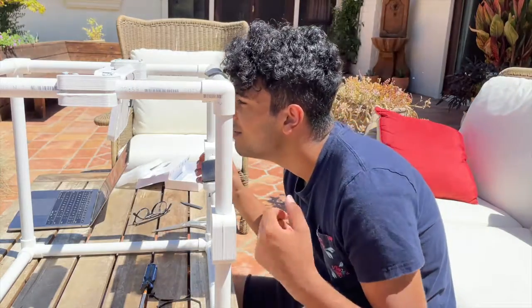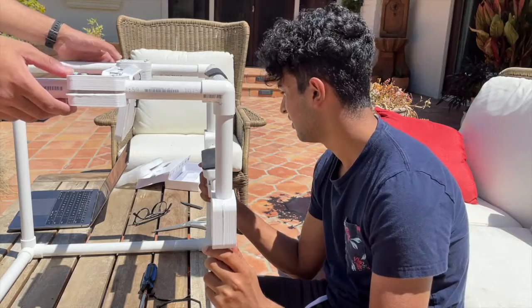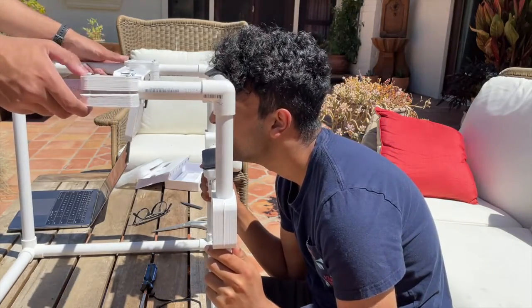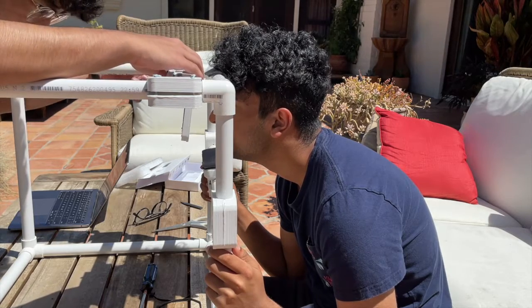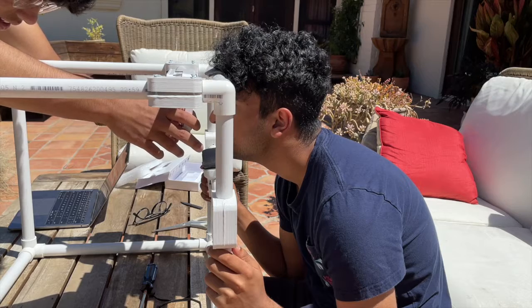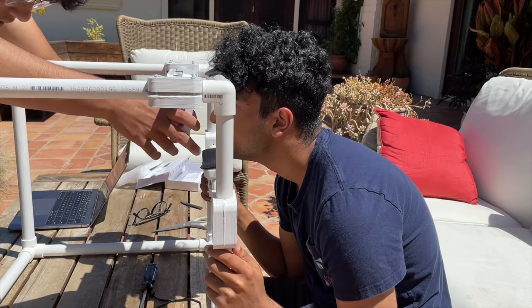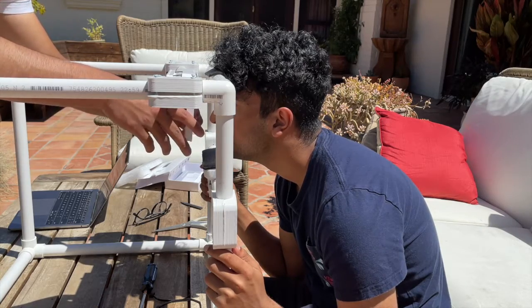Lastly, we will show you how to use the retinal camera with the patient. If they have glasses, they should take those off. Then they should self-adjust the chin rest slide so that their forehead is on the padding and their chin is on the chin rest. Then you as the operator should move the slide as close as possible to the eye, and then adjust the slide so that we can actually see the retina on the phone. And then we can take the picture as we showed earlier.